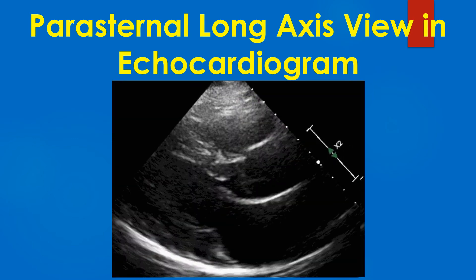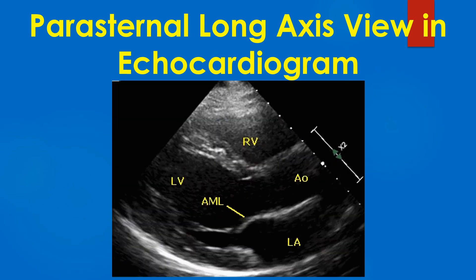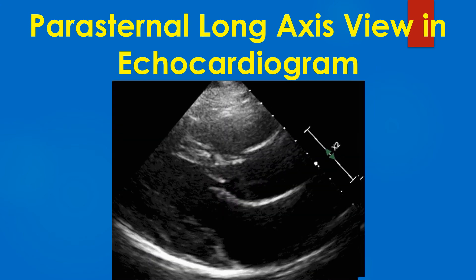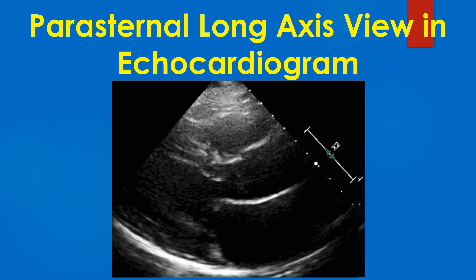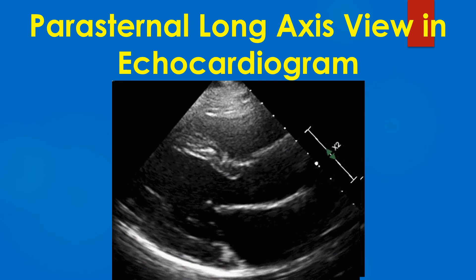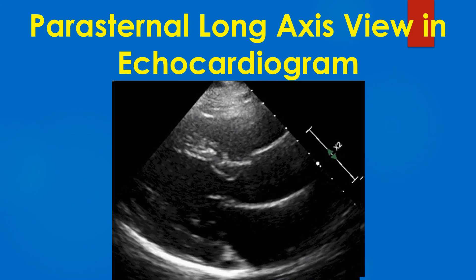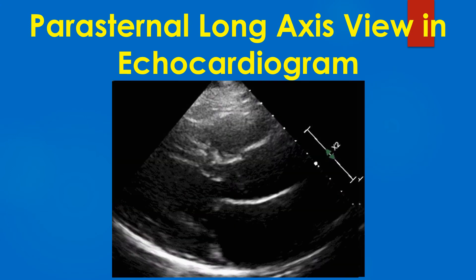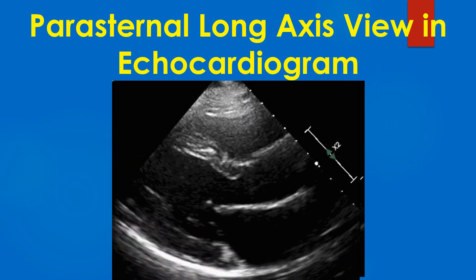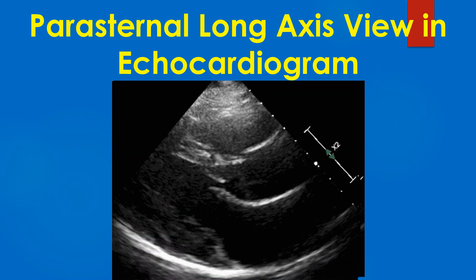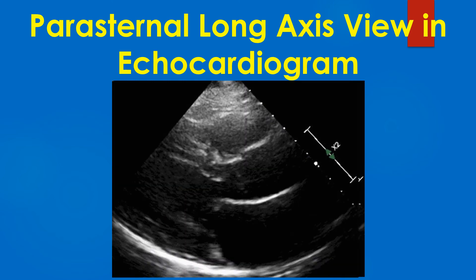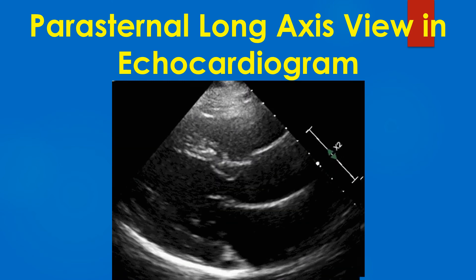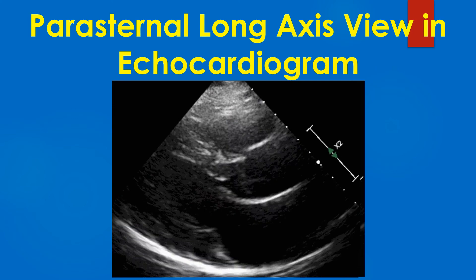Parasternal long axis view is often the first view obtained during an echocardiographic study. It is used to guide M-Mode echocardiography for left ventricular measurements. Initially, the parasternal long axis view is obtained, and when satisfactory images are available after fine adjustments of the transducer position, the M-Mode cursor is placed at the chordal level. Then the M-Mode button is pressed so that M-Mode tracings are obtained.